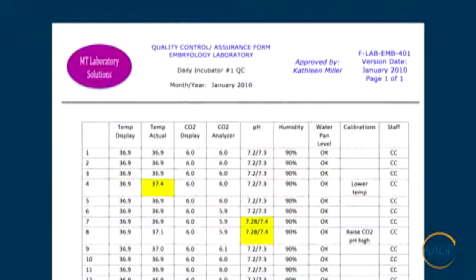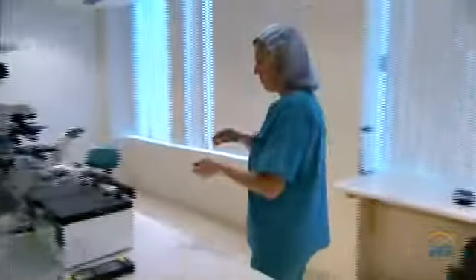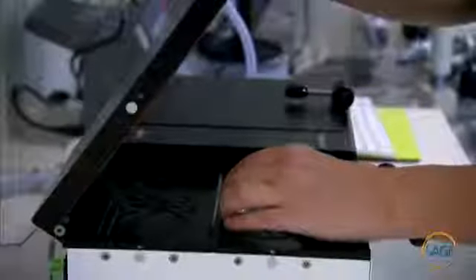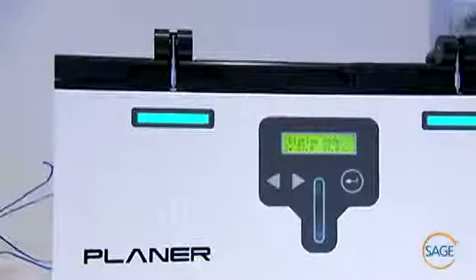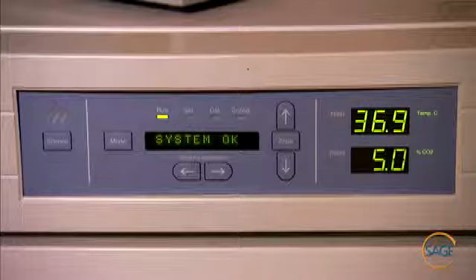Since incubators and warming surfaces and devices are prone to drift in and out of calibration during normal operation, the IVF laboratory should use equipment with a steady temperature profile. The laboratory needs an adequate number of incubators to alleviate excessive door openings and fluctuations in the thermal and gaseous phases of the incubators. Separate incubators for media equilibration and embryo culture should be used in the laboratory to minimize the embryo's exposure to unnecessary temperature and pH shifts.